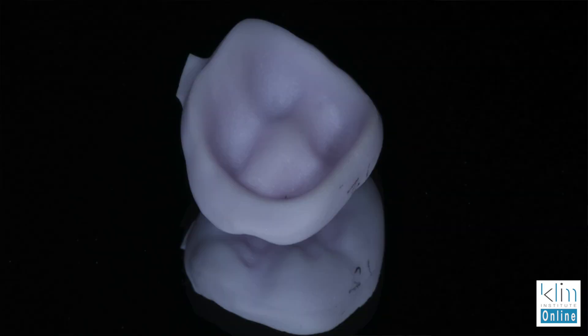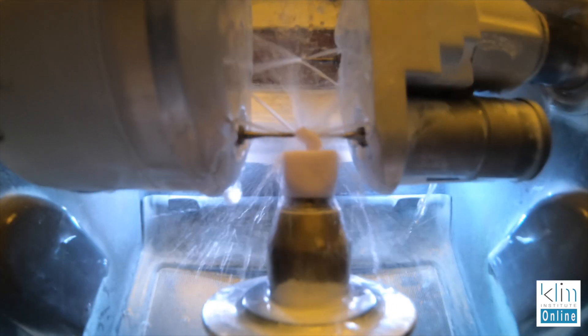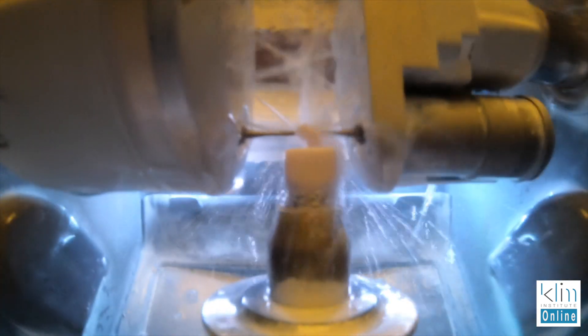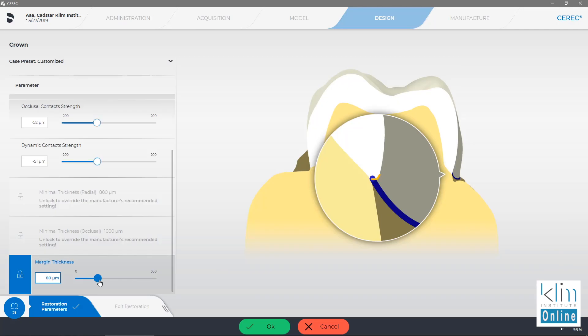At 100 microns with the current version of the software, I'm getting a really clean mill from a chamfer to a shoulder. Now if I'm down to a feather, I'm going to use the EF Burr Mill. But in most cases for bread and butter dentistry, I want 100 microns marginal thickness.